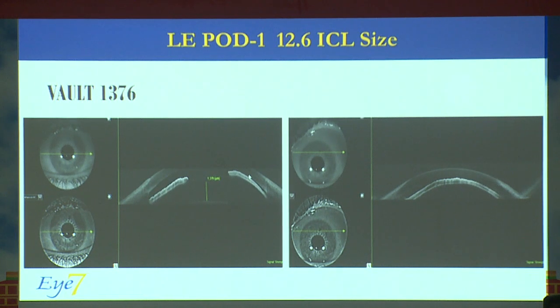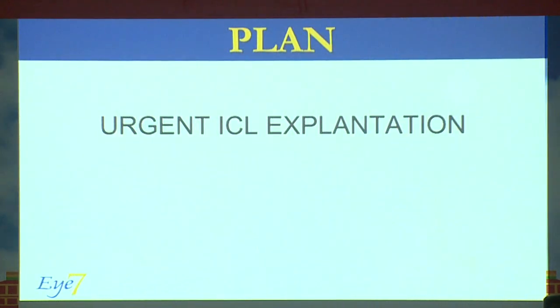This was really high. Do we wait and watch for the vault to come down? No, we can't afford to. Anytime it will go into an angle closure. We have to do something fast. So it was decided we do an urgent explant.